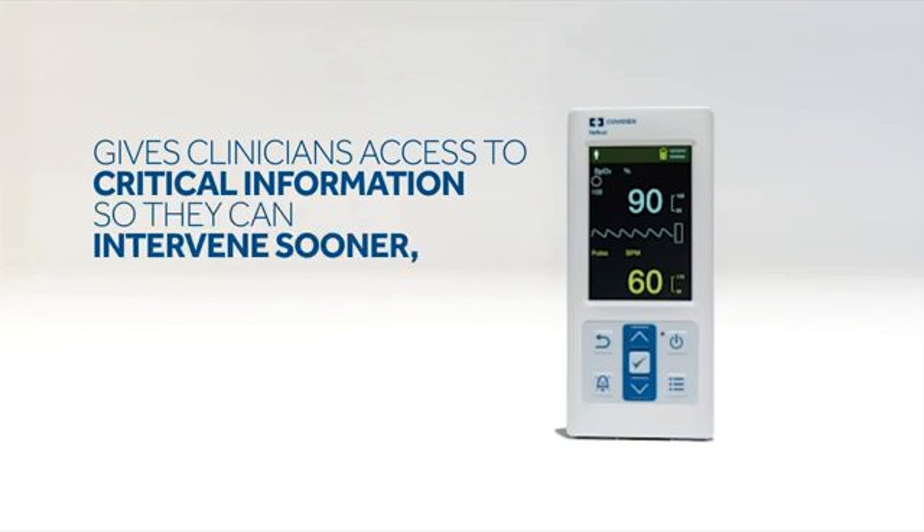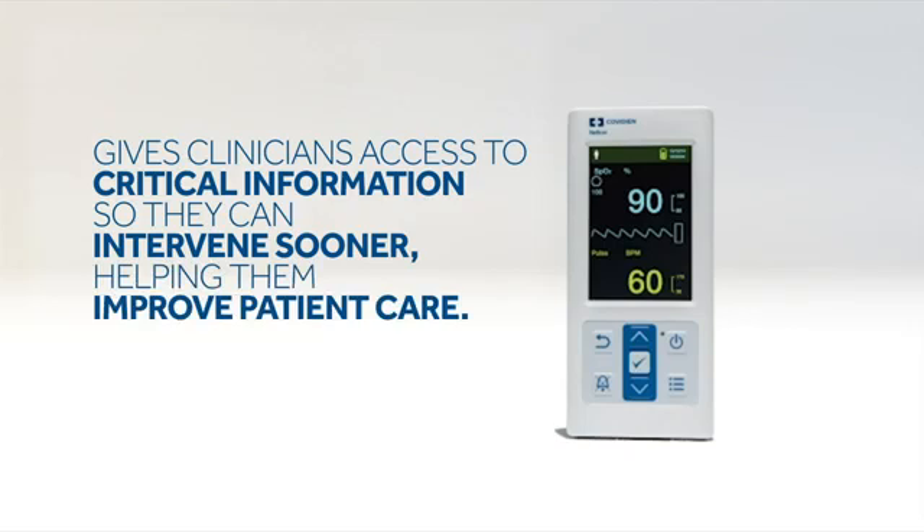Its lightweight design and simple features make it intuitive to use and easy to operate. With its highly accurate readings, the PM10N is an excellent tool for a variety of tests, such as the six-minute walk test, CCHD screening in newborns, and the car seat challenge.